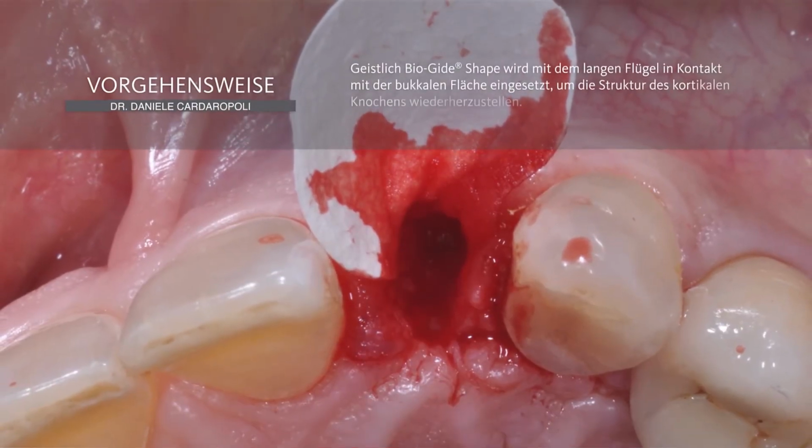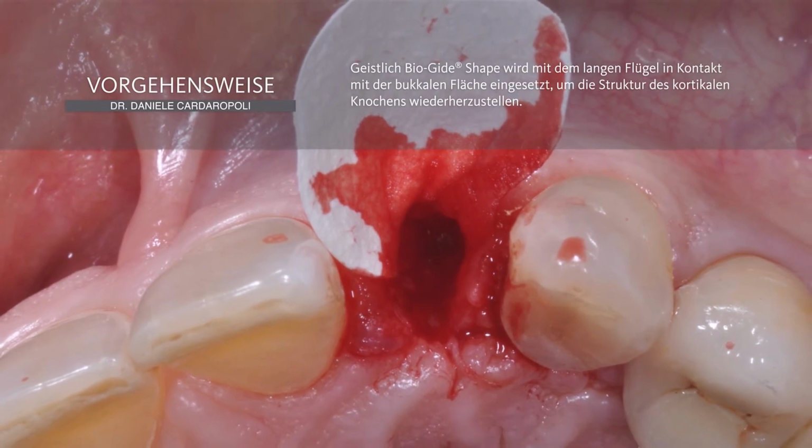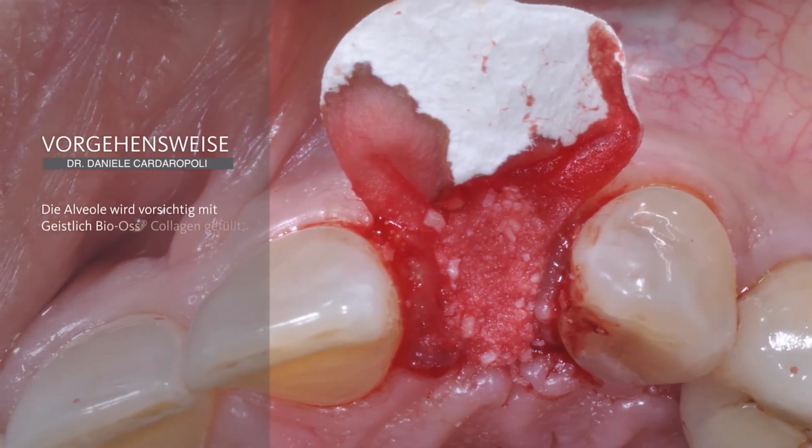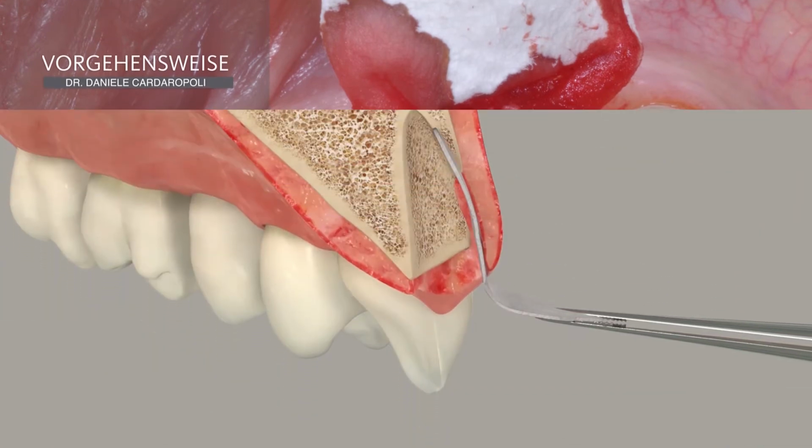After the debridement of the socket, we insert the Bioguide shape with the long wing of the membrane in contact with the buccal side of the alveolus. And after this, we start with the grafting of the socket using a bone graft. Specifically, we use Geistlich Bio-Oss Collagen that is a biomaterial suitable for ridge preservation.